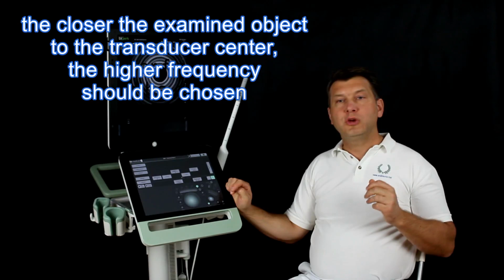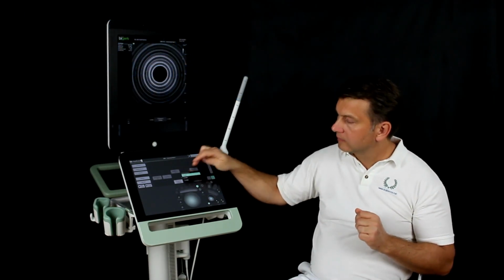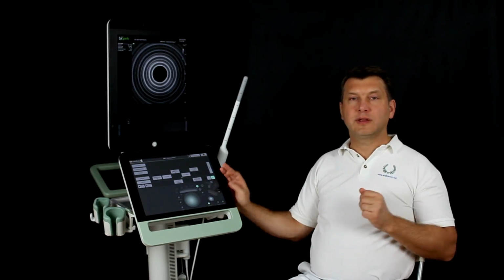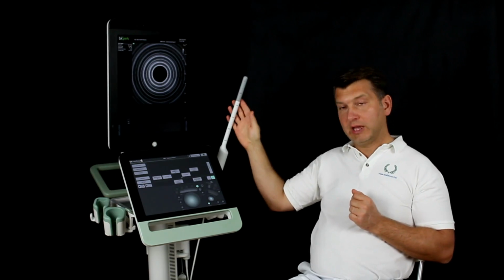For an overview, we should choose between 9 and 10 MHz. This allows to show structures that are farther away from the probe properly as well.